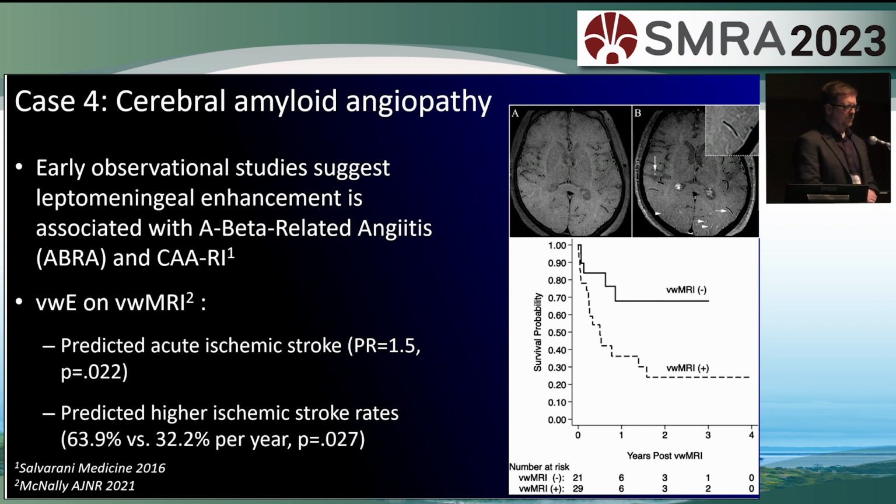We found in our study with Akiko Sakata that vessel wall enhancement predicts not only concurrent ischemic strokes, but follow-up strokes, up to a 60% stroke risk in patients with wall enhancement.